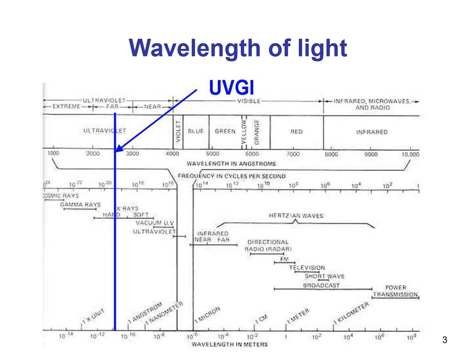The purple light you see from the UV fixture is not the UVGI frequency. The glow you see does not have anything to do with the UVGI wavelength. It just means that the lamp is arcing and generating blue light. Don't rely on seeing the purple light to assume the UVGI is working. Specific measurement devices are required, which we will discuss later in the talk.